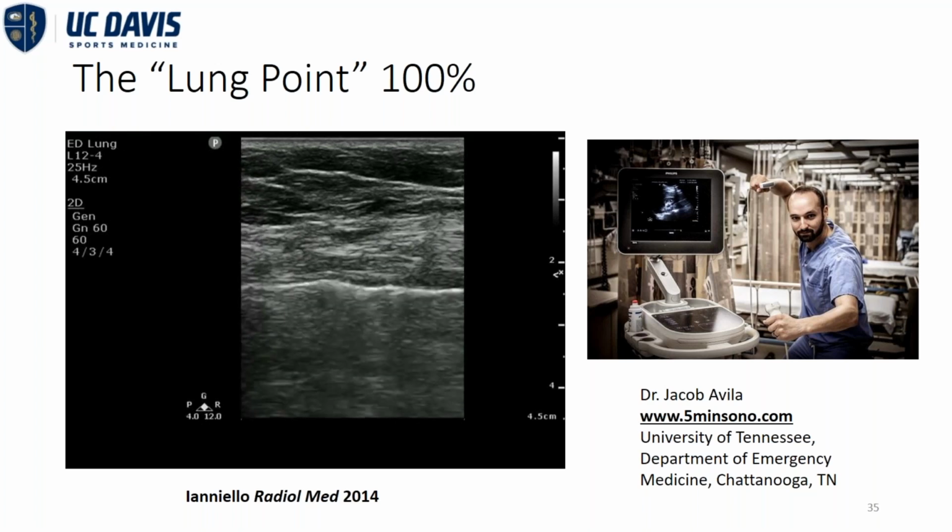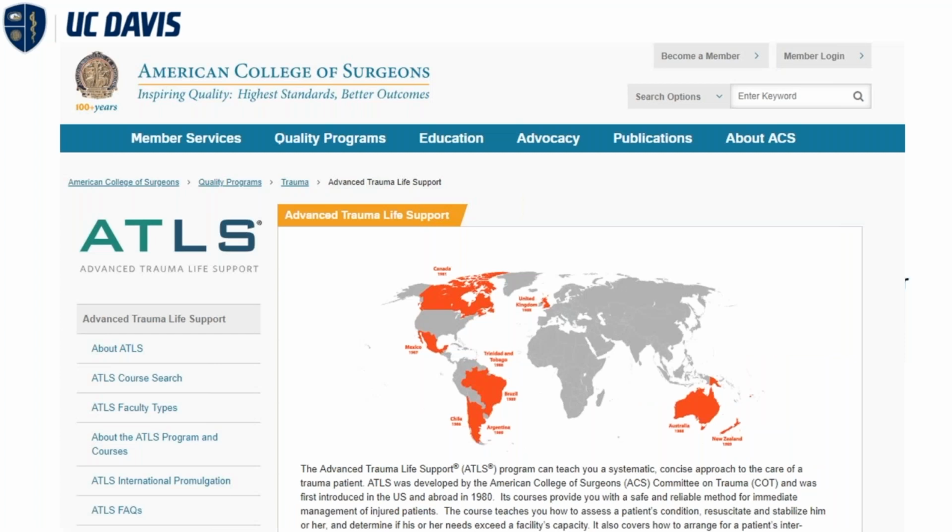Now all of this is pretty great stuff. It's so great that it's endorsed by the American College of Surgeons and is a component of the Advanced Trauma Life Support. So this is not just me being a crazy Yahoo. This is something that has been fully endorsed in the use of evaluating the traumatically injured patient.